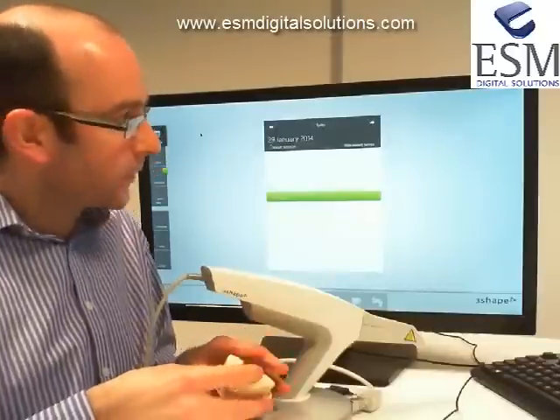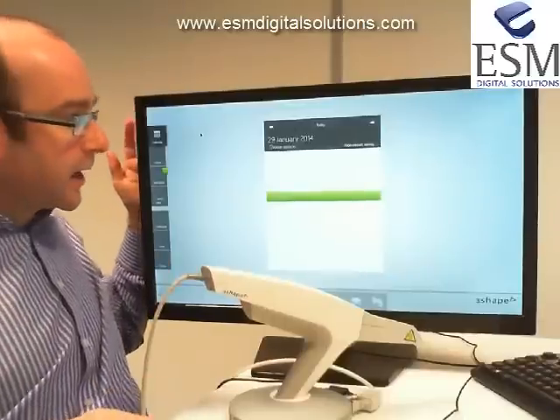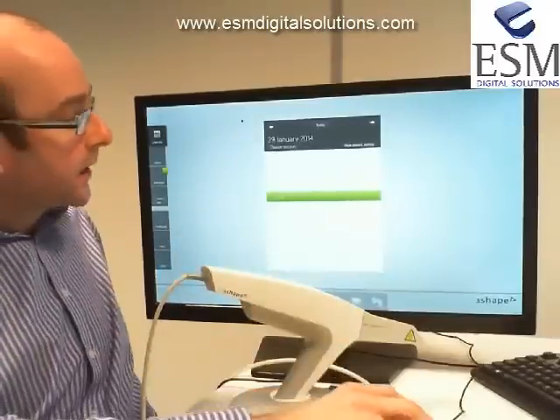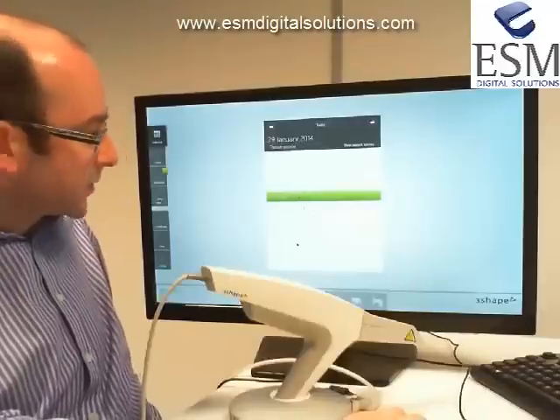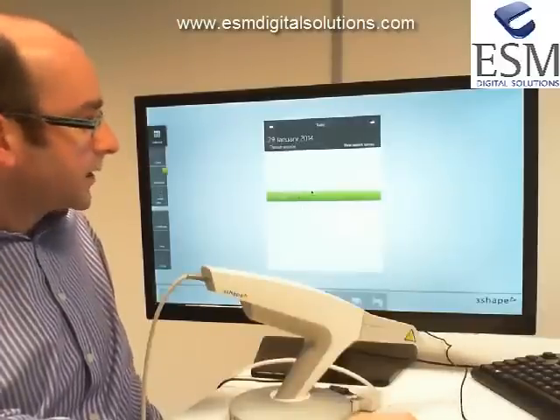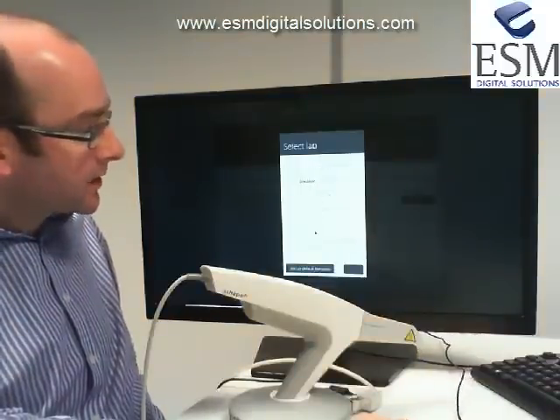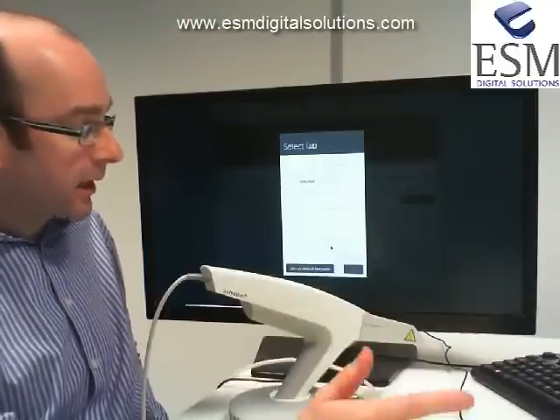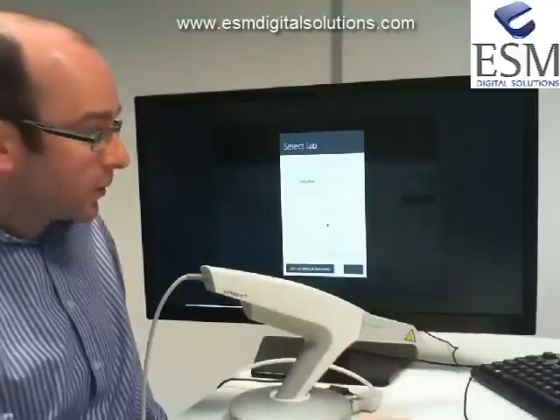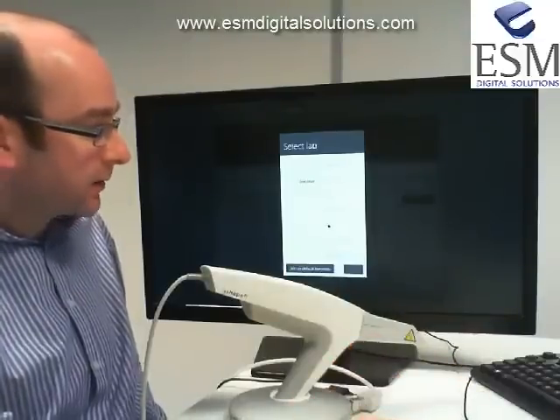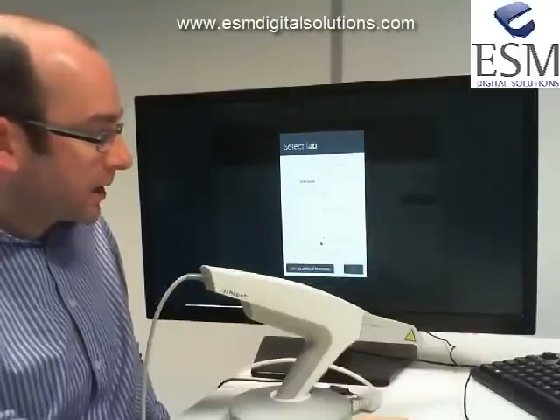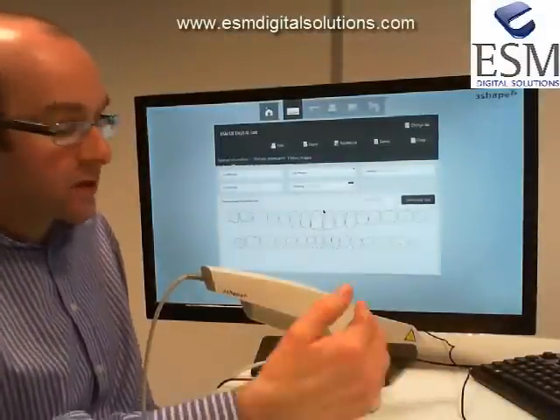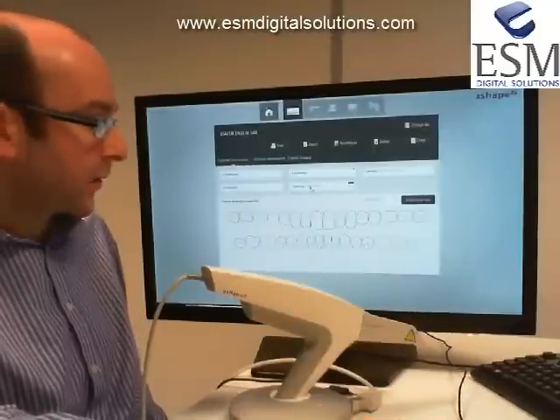Let's start off with the software. This is our welcome screen, where we're presented with the calendar for today. To create a new order, we can select the relevant time slot or create a new order on the fly. The software asks where the data is going to go. As an orthodontic case, it's likely going to your internal database. Alternatively, you can send a scan straight out to your preferred TRIOS-ready lab by selecting the lab from the list. I'm going to select the practice ortho lab, meaning the data will reside in-house on your ortho analyzer database.